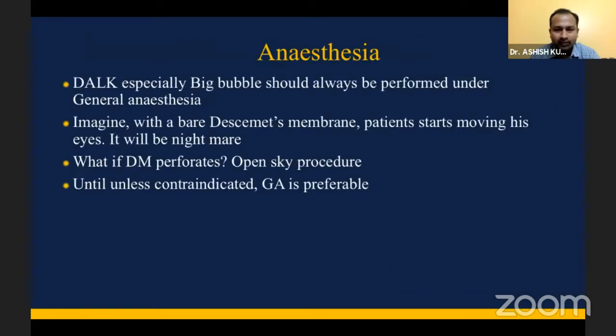So A is anesthesia. As very nicely mentioned by Soham, for a DALK you always want to operate under general anesthesia. It's a bit prolonged surgery. And also the target here is to bare the Descemet's membrane. So imagine a situation where you have bared the Descemet's membrane and the patient starts moving the eye. It'll be nothing less than a nightmare. And also imagine if you perforate the DM, then it's an open sky procedure, where also you want to be under general anesthesia. So unless contraindicated, general anesthesia is preferable.